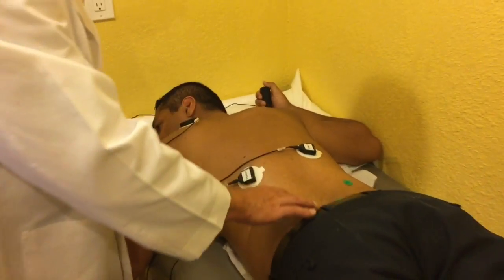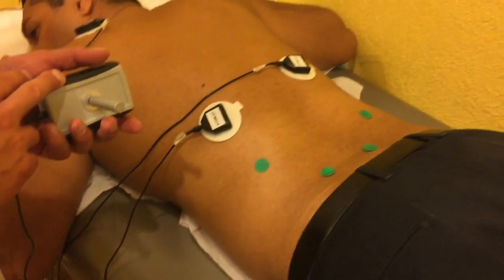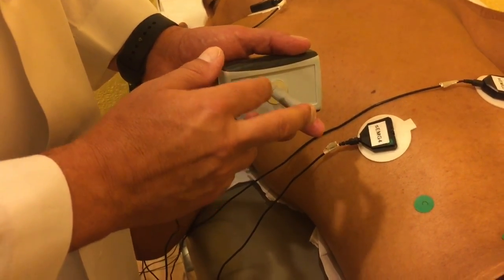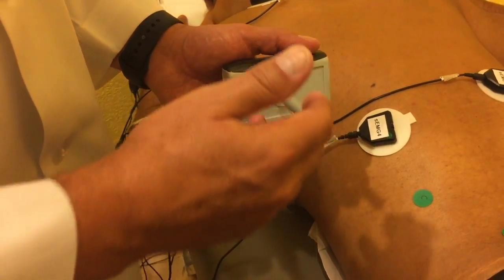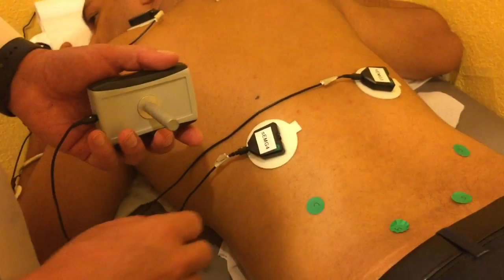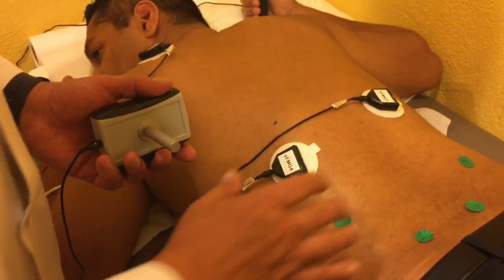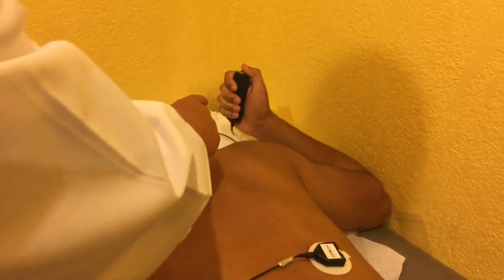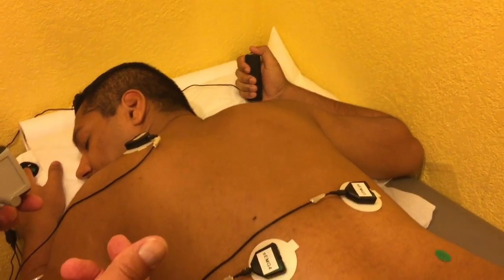We're going to measure with algometry using the algometer. This is going to apply a pressure. It is going to measure the pressure applied, allow us to record the amount of tenderness that is required to stimulate onset of pain. Patient will be instructed to press the trigger when they note onset of pain.